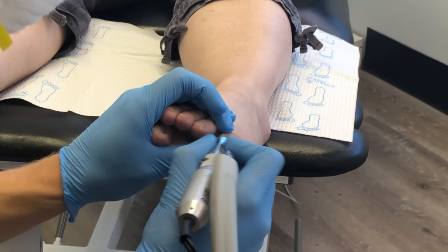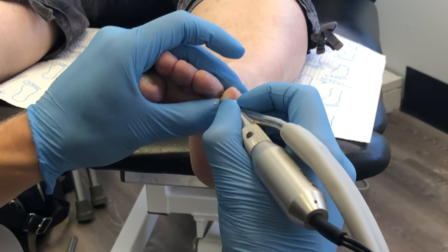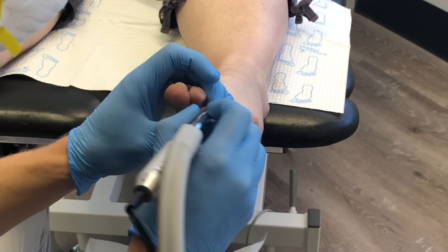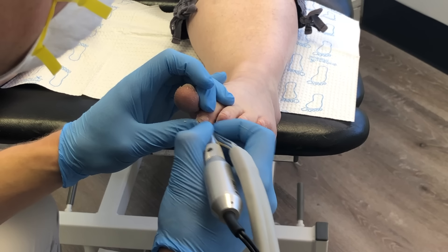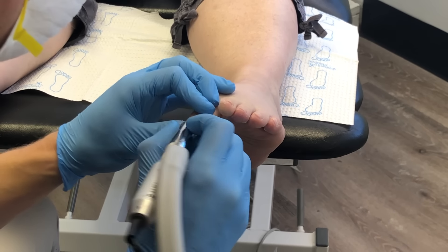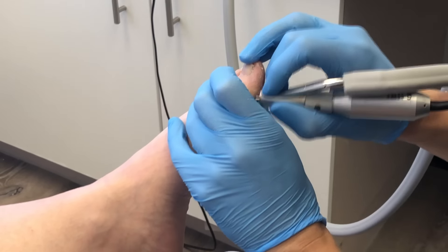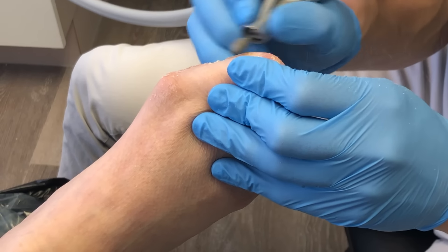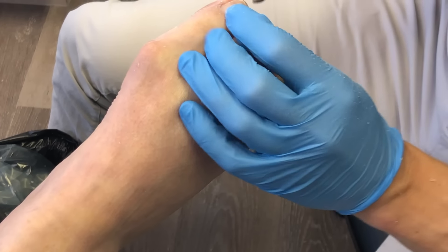Here we're filing the nails as a finishing step to make sure all the nails are nice and smooth. The electric file saves my wrist compared to a hand file. I'll also use the burr on the end of the toes to smooth any little bit of callusing there. A burr is a nice tool for fine detail — a larger Moore's disc could irritate or cut the tissue in those areas.